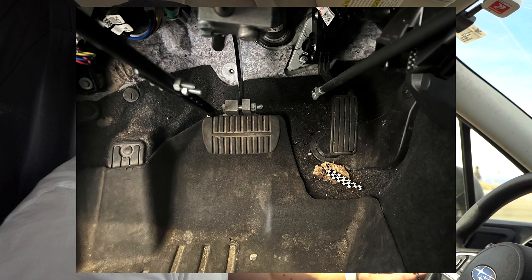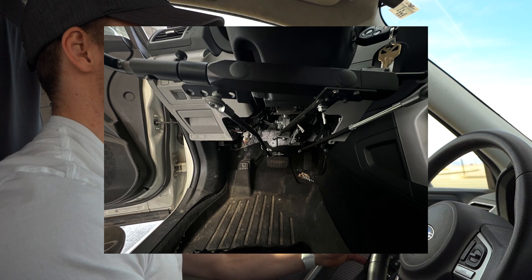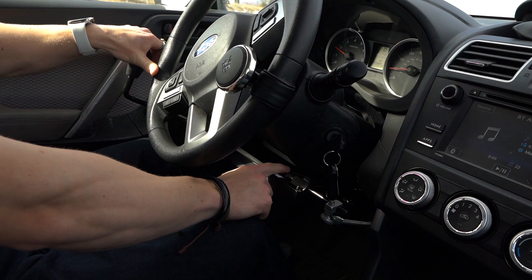We'll put a picture in and show you really how this connects to the gas and brake. It's a purely mechanical system and it's a very smart system too. Right here you can see where I'm hitting the brake, but when I hit the gas, I'm pulling this back.